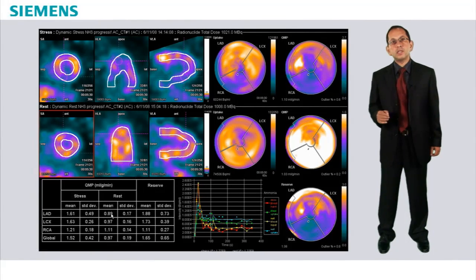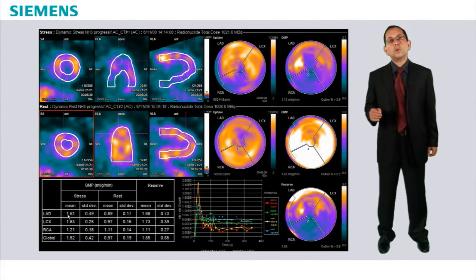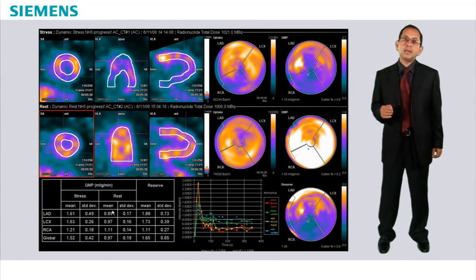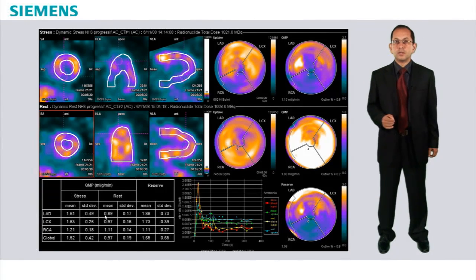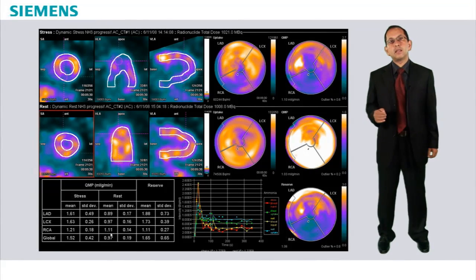However, we also see that there is significantly lower flow in the LAD and left circumflex areas. The resting flow is fairly normal and well preserved in the LAD and left circumflex, as well as in the RCA territories.